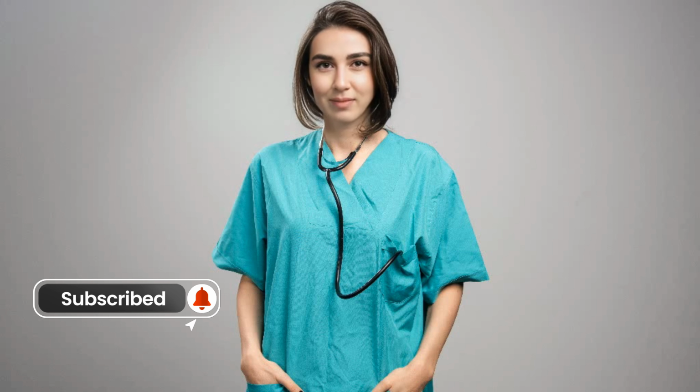Angioplasty is a medical procedure used to open narrowed or blocked blood vessels, particularly arteries, which supply blood to the heart. In the case of coronary angioplasty, it's commonly used to treat coronary artery disease, which can lead to heart attacks or other heart issues if untreated.